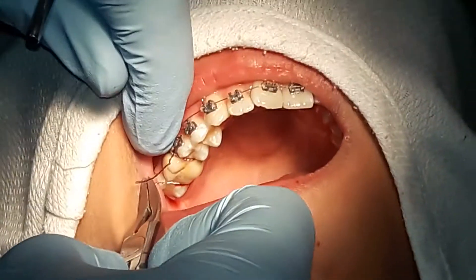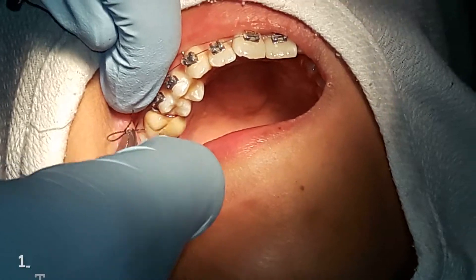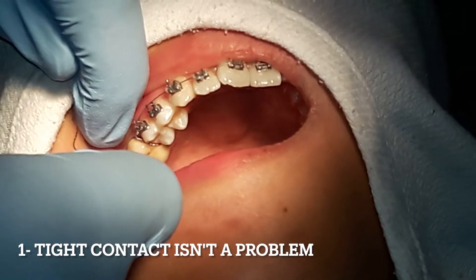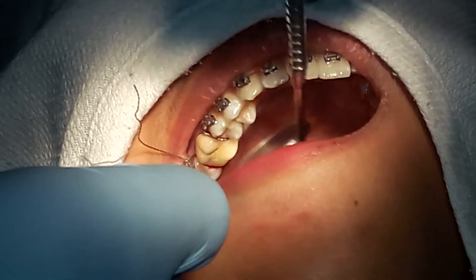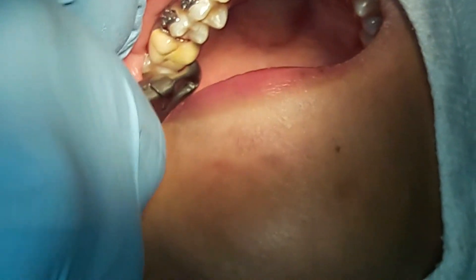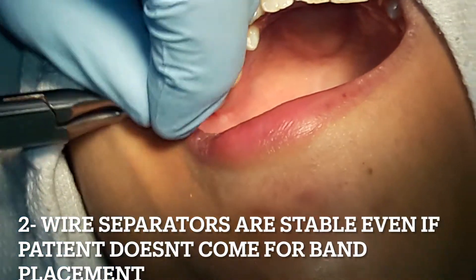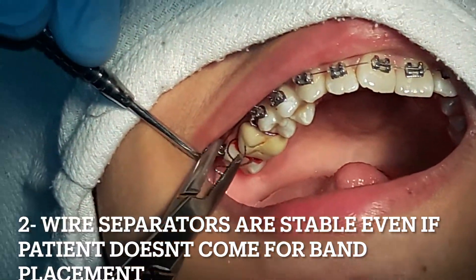Why am I not using elastic separators? Number one, if the contact is super tight then it would be impossible to insert the elastic separators without cutting it. Number two, if the patient does not come back for their scheduled band insertion appointment, the elastic separators could fall off and the space will close again.